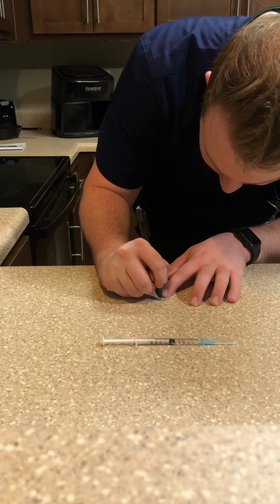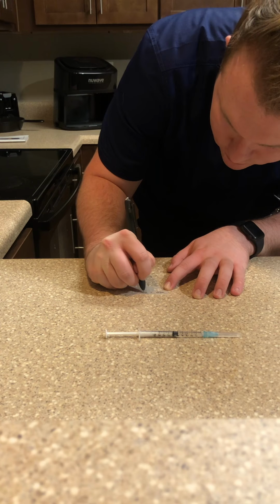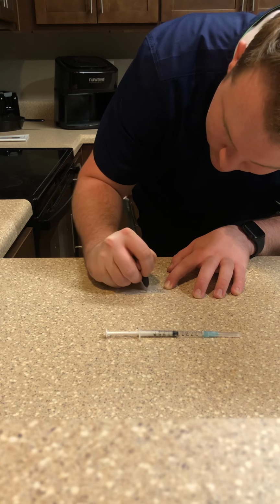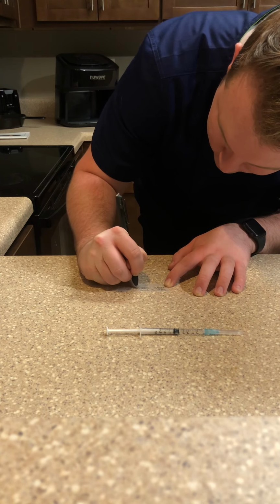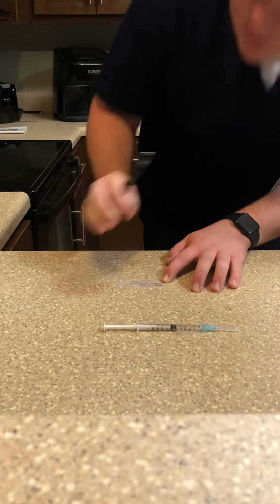So I'm going to write Jaguar J. Jones, heparin, 5,000 units, and I'm giving 0.5 milliliters.